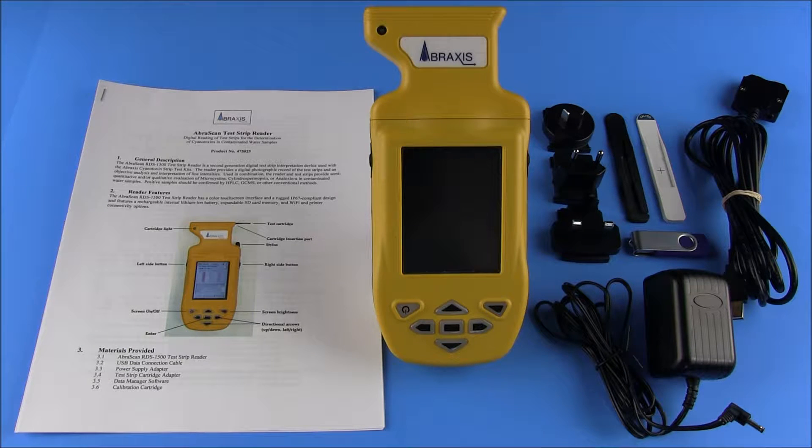The AbraScan reader comes with a user's manual, the reader, a USB cable, a power adapter, and interchangeable voltage adapters allowing for charging of the reader regardless of user location. Two cartridges are also provided: a strip cartridge for reading of test strips, and a calibration cartridge for use in maintaining calibration of the reader's hardware. A flash drive which contains the data manager software is also included.